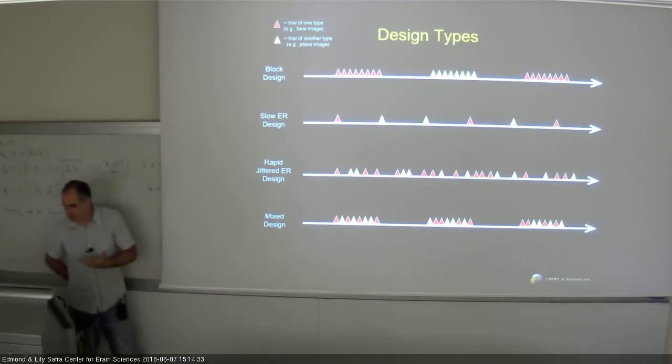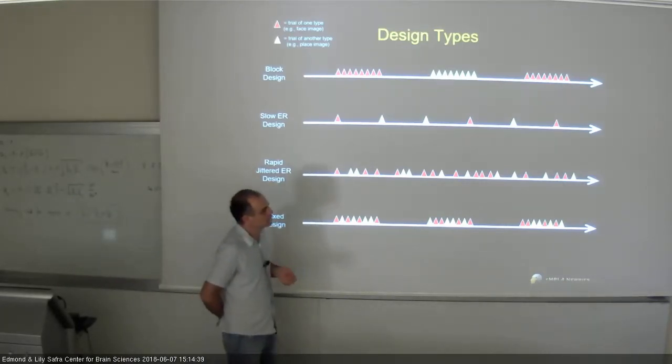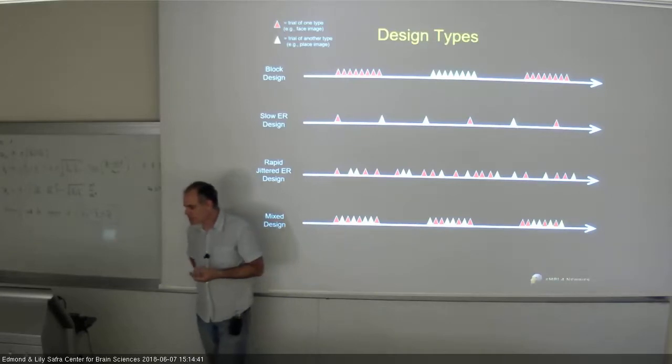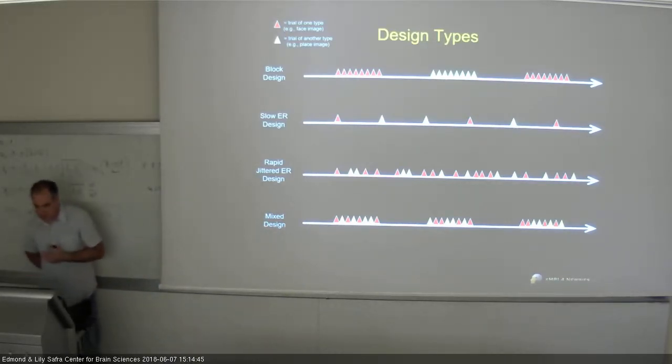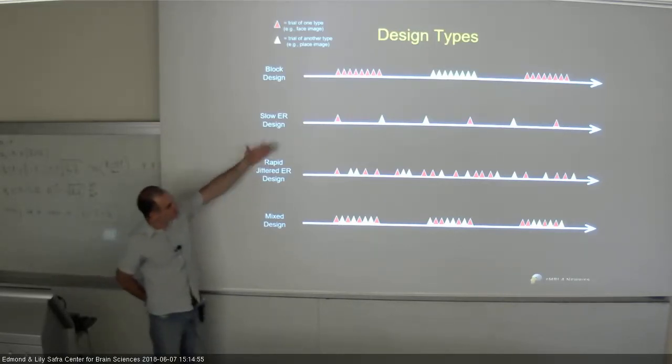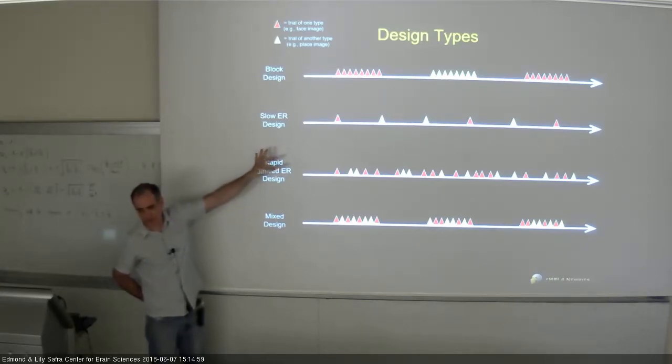So I really am wasting a lot of time here, and time is also not comfortable for the person inside, but it's also money. Okay, we're very constrained. MRI is expensive stuff. You want to minimize the time in the MRI. So I think we'll see that in a couple of minutes again, but I think the disadvantages are clear here, but there are some advantages here also, and I'll get back to that in a few slides.